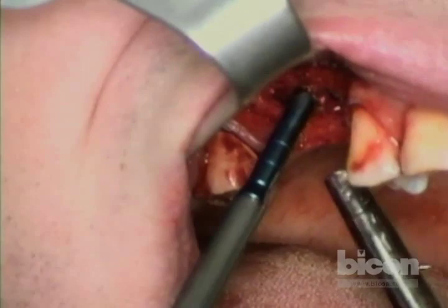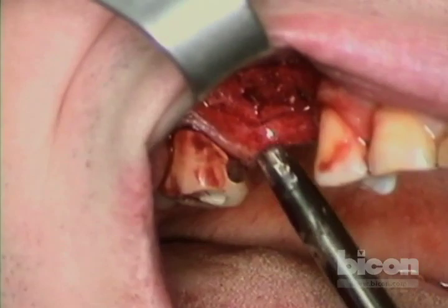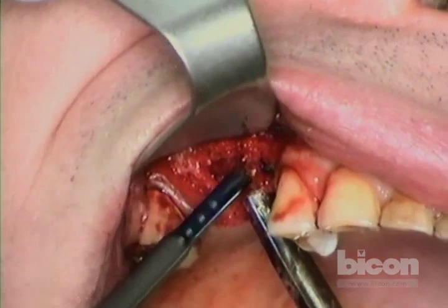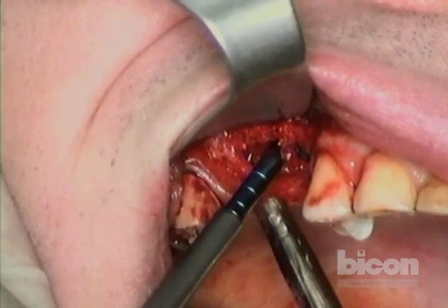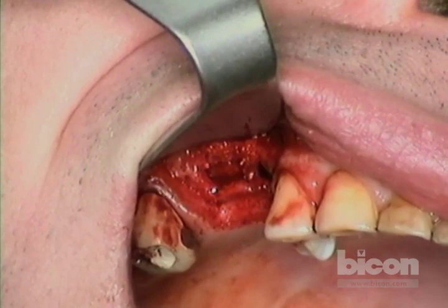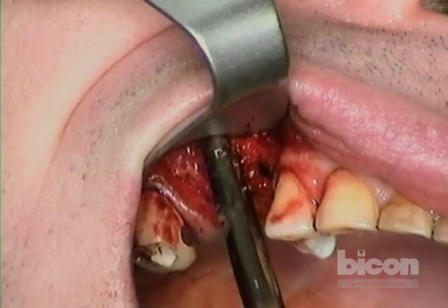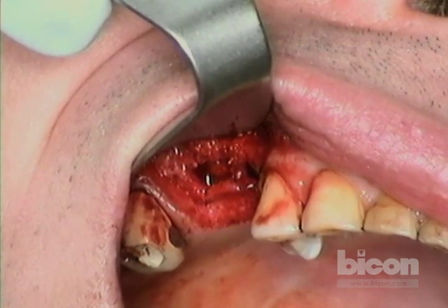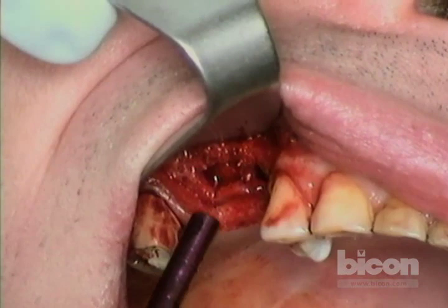Can you see how the rectangle just started moving into the sinus — or really the alveolar process, which has been occupied by sinus expansion? It is key to wait a little bit, because there's some swelling and inflammation from the lifting of the sinus membrane. Give it time to release and relax, and then we'll start pushing it up. I'll use the five-millimeter — or maybe the four-millimeter — floor transport sinus floor osteotome and tap it up just a little bit more.